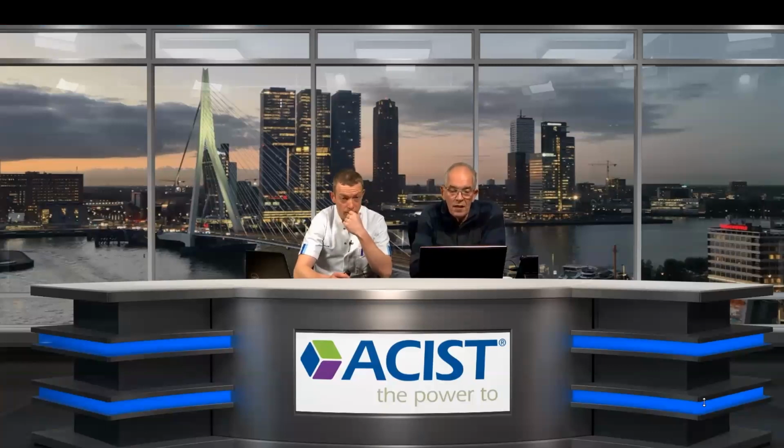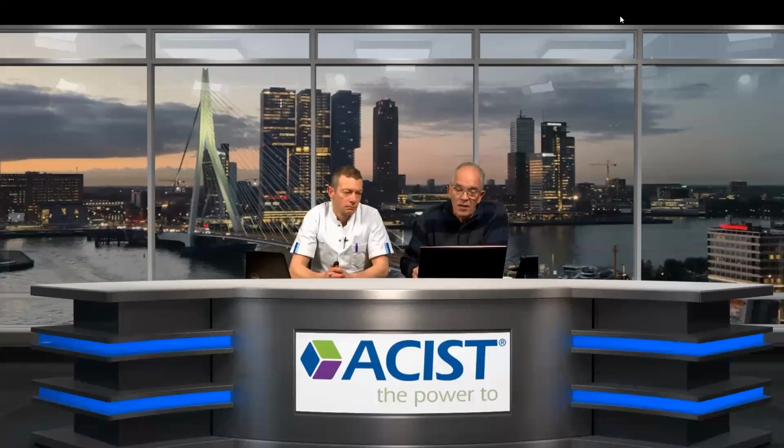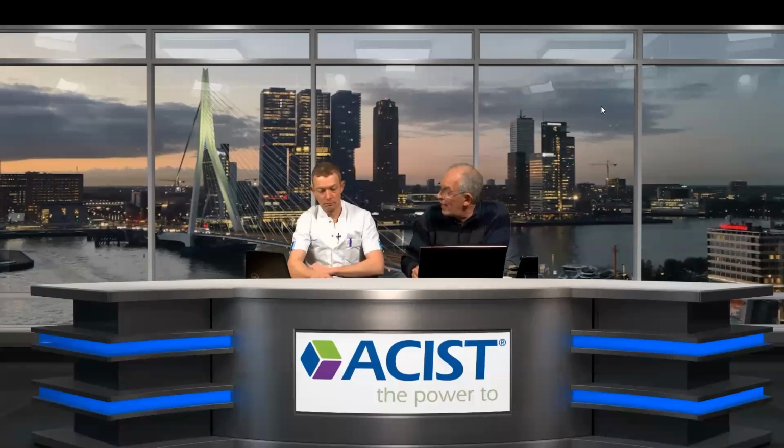Yeah, well, thank you, Joost. About the additional comments, I think it was quite clear. And what is important to say, as I saw in one of the slides coming, that you had a number about thickness of calcium, that it's more than 0.5 millimeter, which you can measure on OCT.